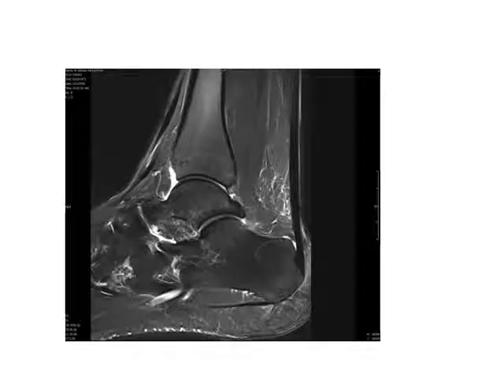Alrighty, so here's an example of how, even though it's a dark bone, it still looks like it's being outlined with black marker. You can still see the outline of the bone. Now look how nice this is too. Hopefully you can see this, but you can really see the muscles in much more detail than you do on the CAT scanner, definitely compared to the x-rays.